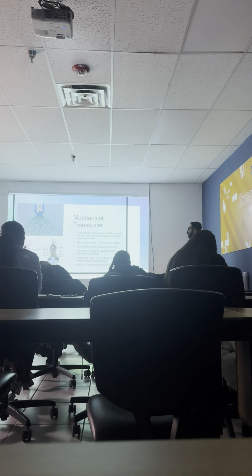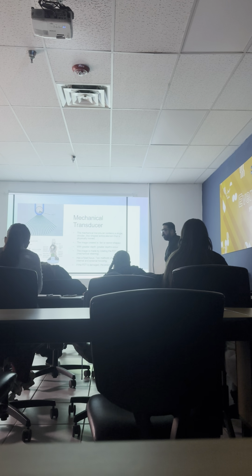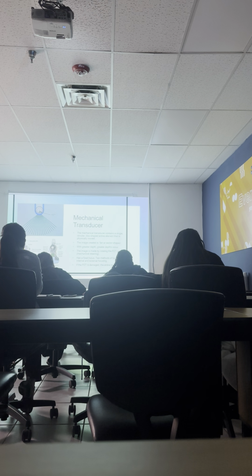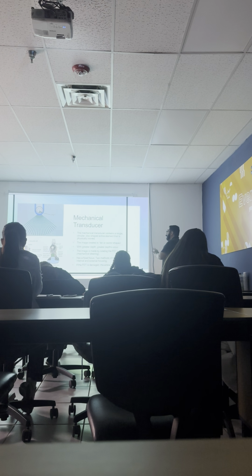Also, we said an acoustic lens, right? So a lens, is that internal or external focusing? External. Okay, so what would internal be? The crystal itself has a shape, right? So if the PZT is damaged in this type of 2D imaging, the entire image is lost.